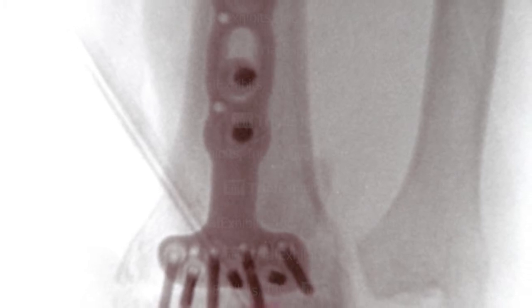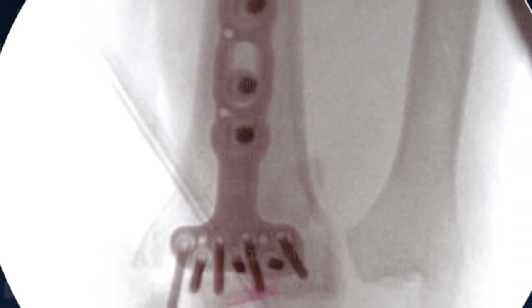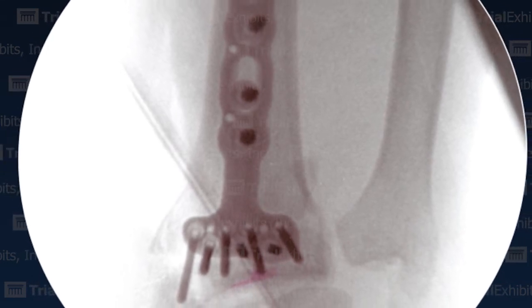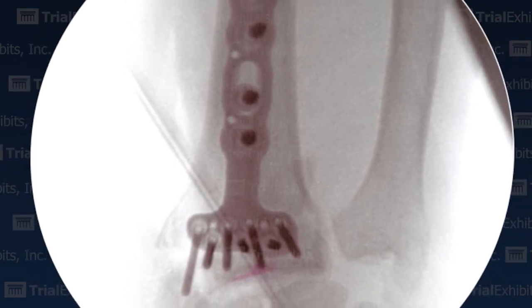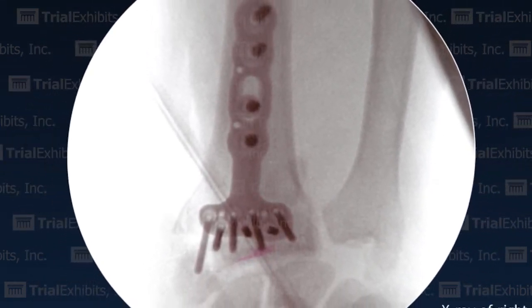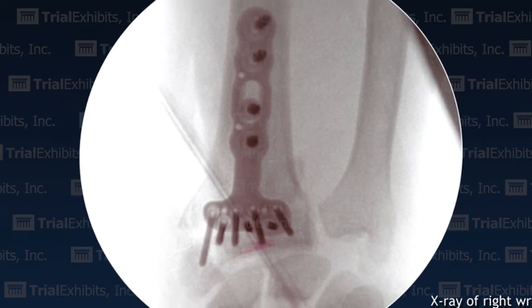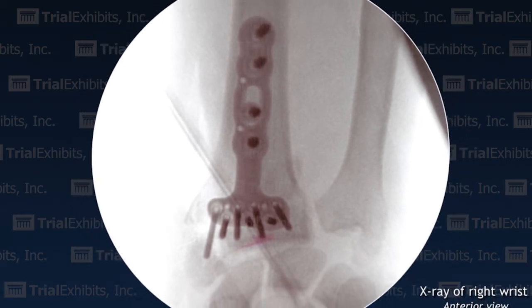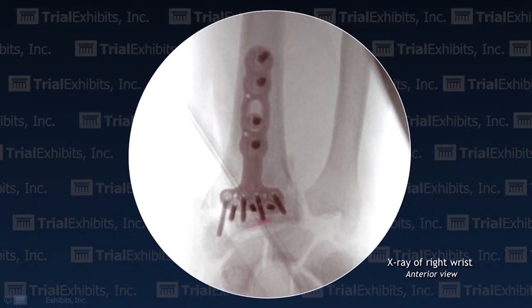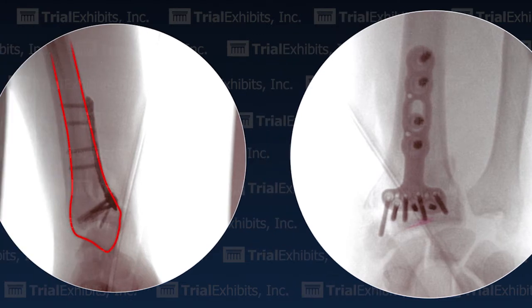Trial Exhibits found a solution to make the truth understandable. Unlike the lateral x-ray, the AP x-ray allows us to see that the screw in question was placed in the radial styloid process and does not penetrate into the joint space.